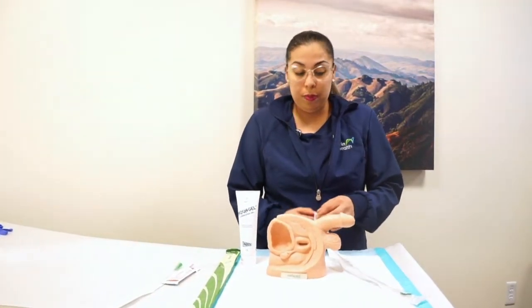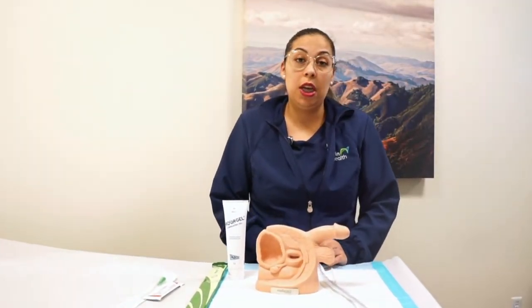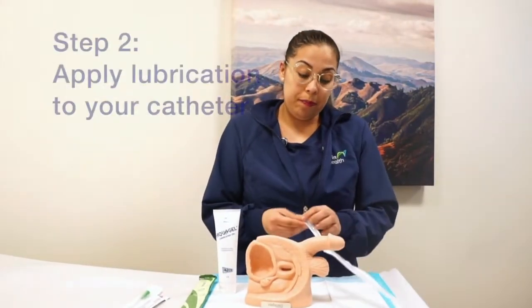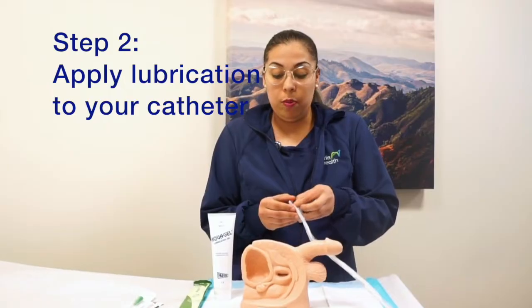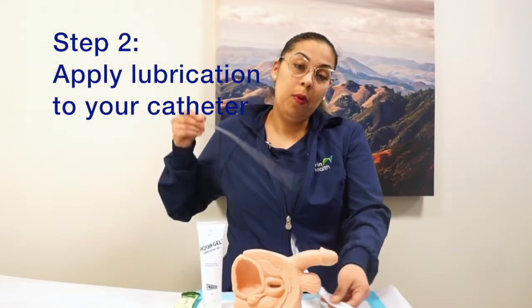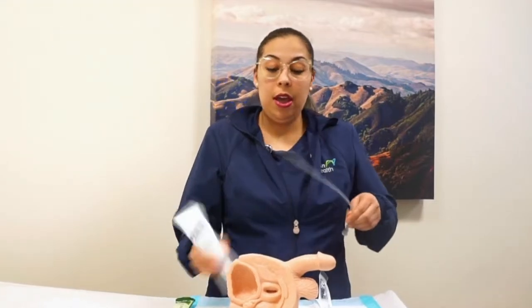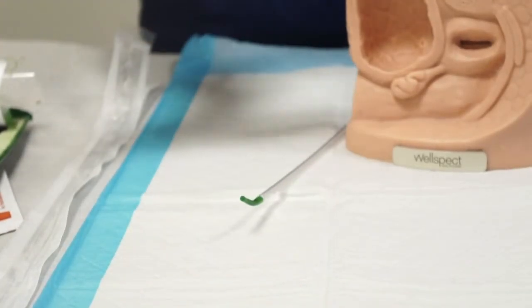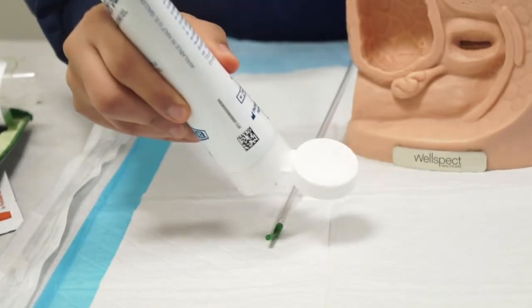You have to open your catheter in a clean area. In the bathroom, you have to clean the counter first and then grab your supplies — your lube and your catheter. Basically, you're going to open the catheter after you've already washed your hands, pull out the catheter, get your lube, and put the lubricant on the tip of the catheter.